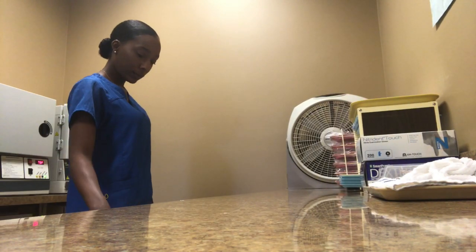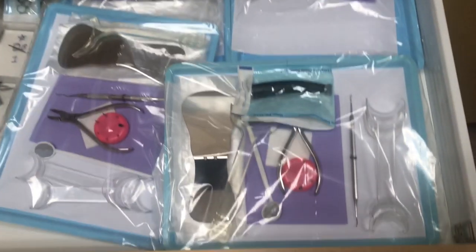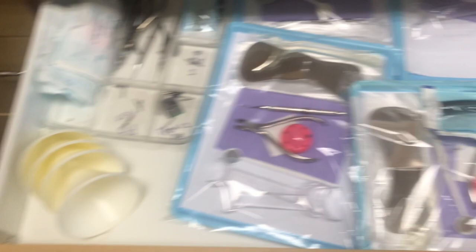For our debond appointments — which are appointments where we take braces off — I will definitely need one of our debond trays, which we keep here in this drawer.